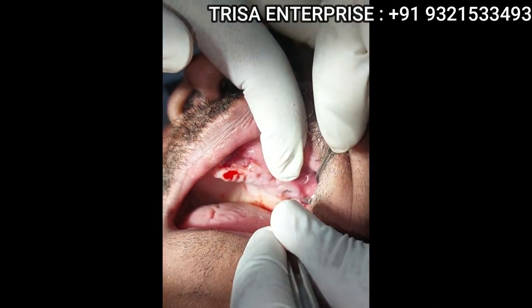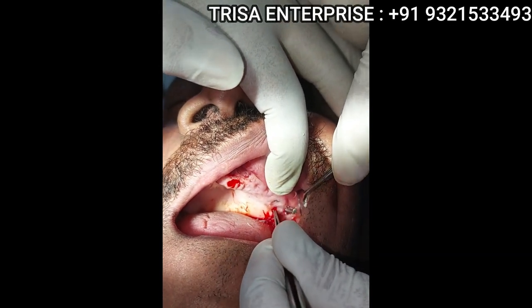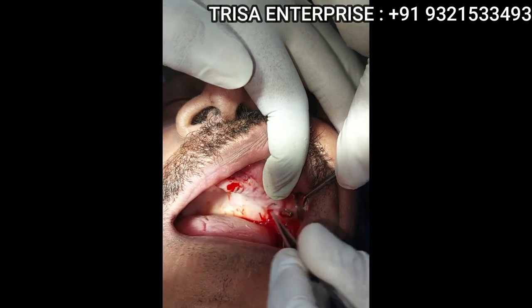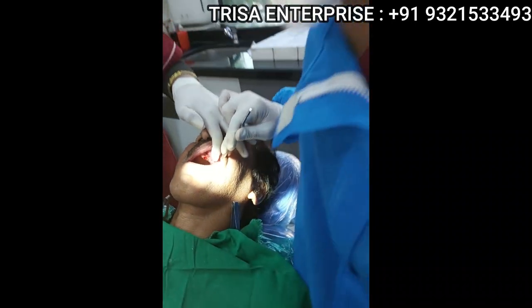As you can see, there is a lot of width available, so we can place the second implant even palatal to this. We can think: one buccal, one palatal. It's not always necessary to do one mesial, one distal — you can do this. Give me one more 3.5 by 23.